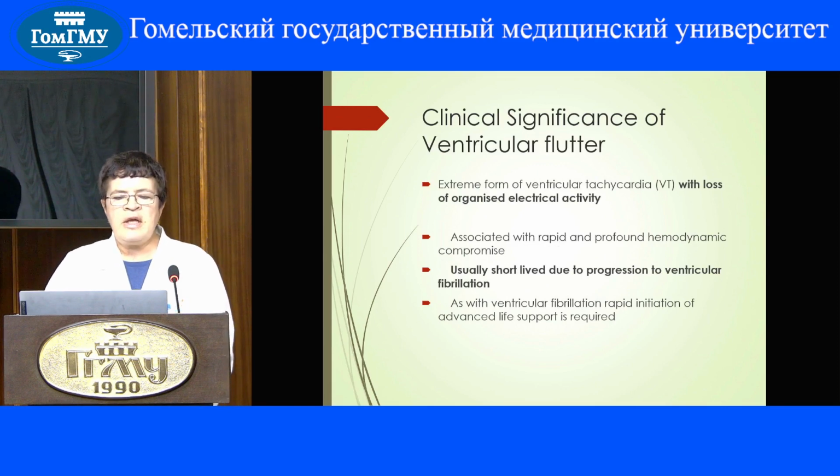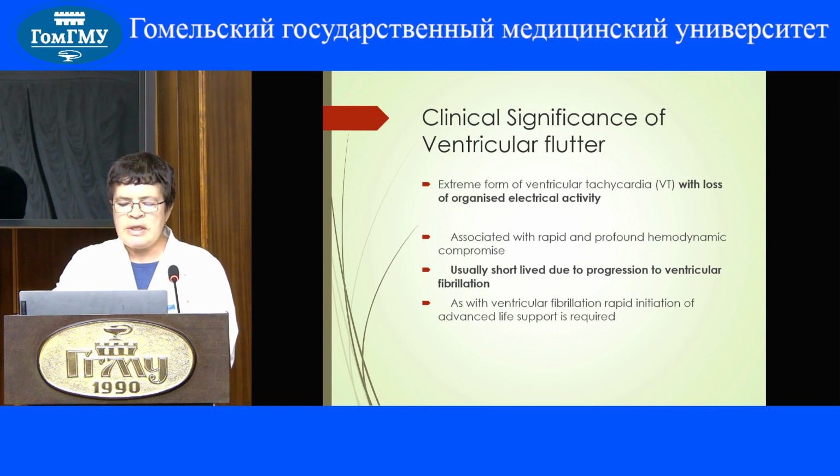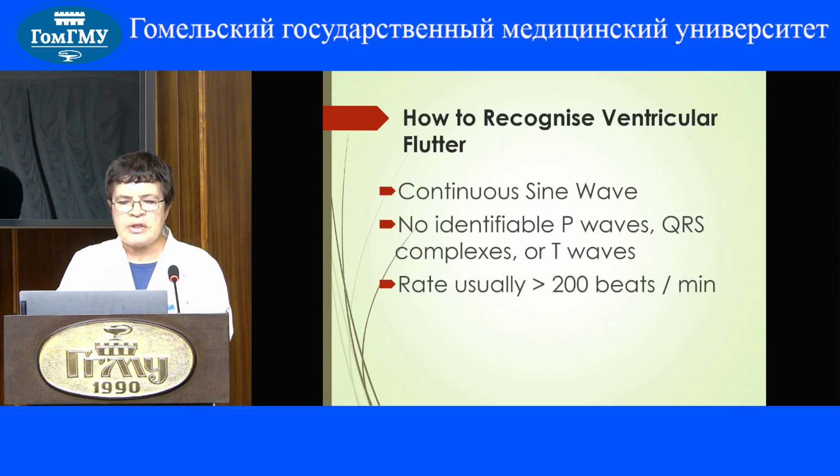Clinical significance of ventricular flutter. Extreme form of ventricular tachycardia with loss of organized electrical activity associated with rapid and profound hemodynamic compromise, usually short-lived due to progression to ventricular fibrillation. As with ventricular fibrillation, rapid initiation of advanced life support is required. How to recognize ventricular flutter? Continuous sine wave, no identifiable P waves, QRS complexes or T waves, and ventricular heart rate is usually more than 200 beats per minute, from 180 to 250 beats per minute.